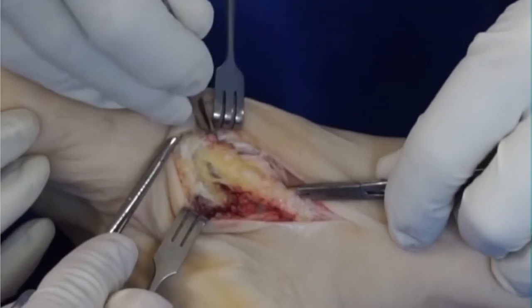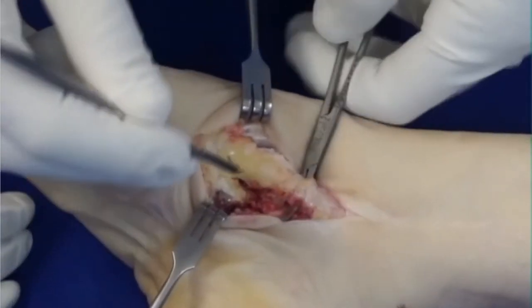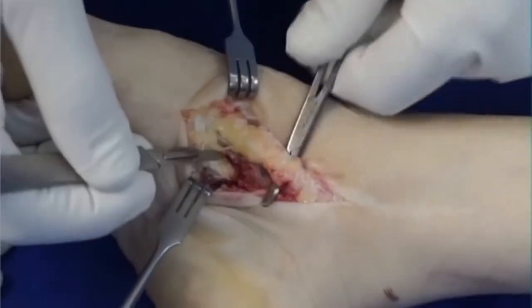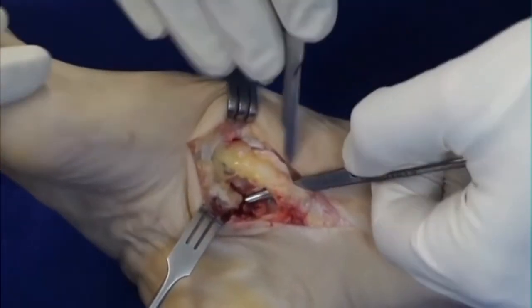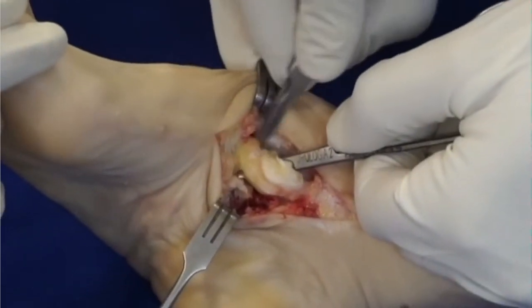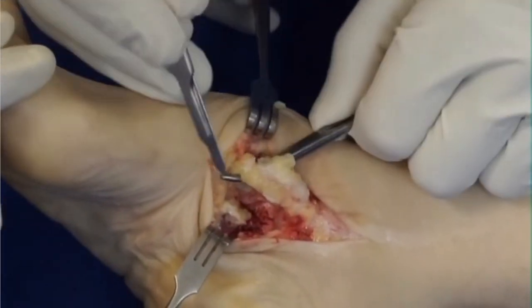Once I've got the tendon dissected, you can see I'm cutting down onto the cuneiform. I'll then elevate it from underneath the cuneiform and then finally cut the tendon, which gives me a nice long piece to work with.